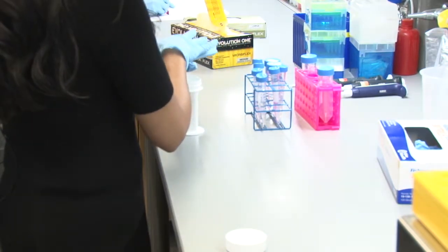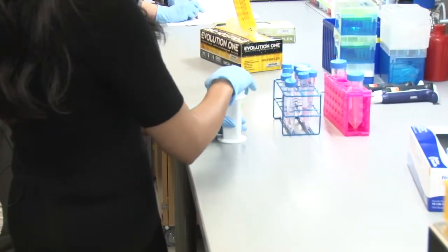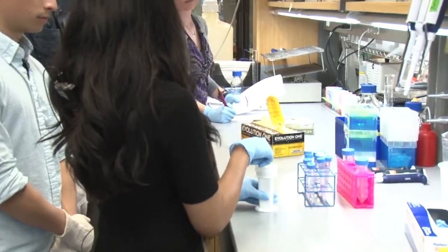I usually fill this with fixator and leave it for 20 minutes at room temperature. Once this is done, or in the meantime while it's incubating, you would prepare your antigen retrieval buffer.